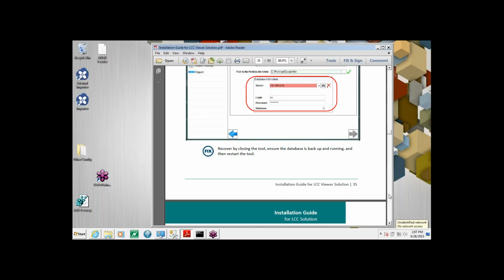The easiest backup that has been done to date on MySQL Community Edition is to have a scheduled task that stops the service, copies the data folder, so the folder where the data files are stored, and then restarts the service. So administratively, MySQL is more complex, less intuitive, less integrated into the Microsoft infrastructure, but it's free. SQL Server is more integrated, easier to manage, but it can be expensive.